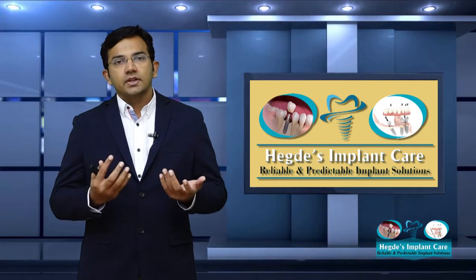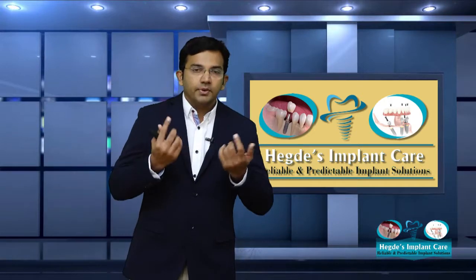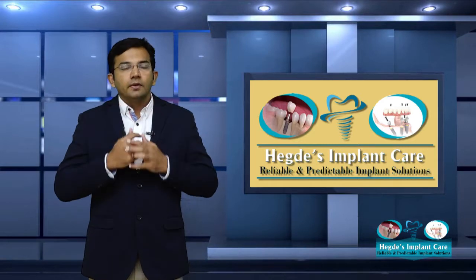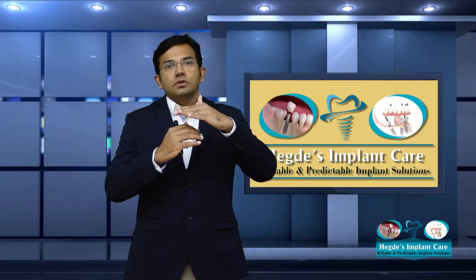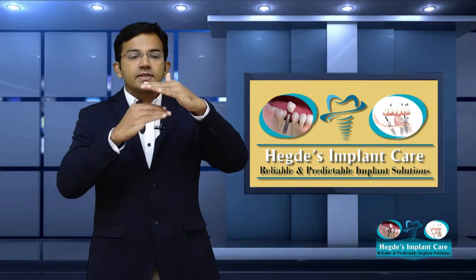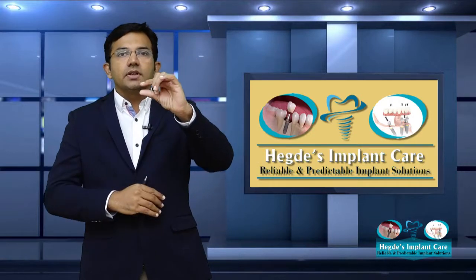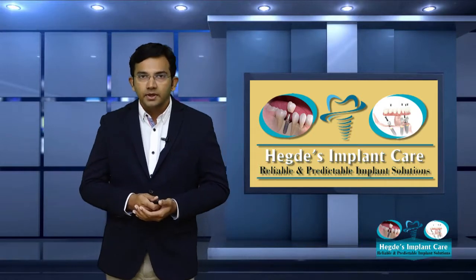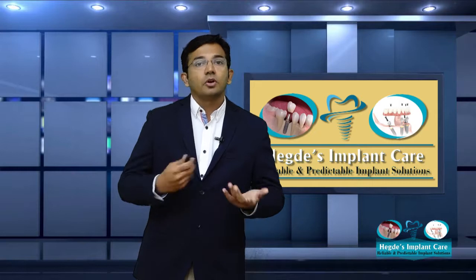In the maxilla, there are some limiting structures. In the upper jaw, we have the maxillary sinus, which goes around there. This sinus is very close to the bone. Sometimes the sinus starts moving down or the bone recedes slightly, and finally we are left with about 5 to 6 mm of bone, which is really not sufficient for dental implants. So in such situations, how do you go about it?